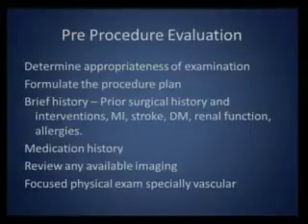So this talk is geared more towards the peripheral arterial disease. I'm bringing this talk to you because you guys don't see much of peripheral arterial disease, right? It's all done by the vascular surgeons here. So know the prior surgical history. Does the patient have anything which will change your plan? Does the patient have a femoral bypass? Does the patient have some other bypass surgery, or a scar in the groin so that you can't access the femoral artery, or is there a reason that they have tried in the past to cannulate the renal artery but could not do it from the groin, so you might have to come from the arm?